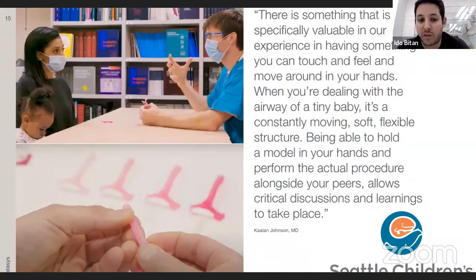Another case is from Seattle Children's Hospital, where they had a case of a baby with a trachea deformity, and this baby had to breathe through a ventilation system until they had a model resembling the trachea that they could operate on pre-op, before the actual surgery, to get confidence that the surgery would work. And only after they did a few iterations on the printed model did the surgeons get the confidence to actually go into the surgery and perform the operation.